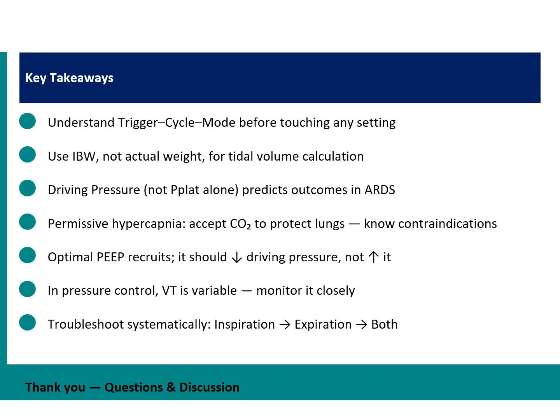It's not that what you are saying cannot be confirmed by your colleague, and you really don't know who is right. Being an ID physician, I like something which is very objective, which I can see and feel, and which can be done in real time. There are a lot of practical issues. You want to use ultrasound, but you have one ultrasound for 15 patients, and someone will be getting a line, someone will be using it for something else. So you cannot always have an ultrasound and do it bedside.